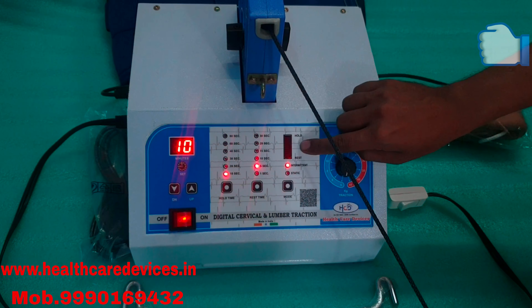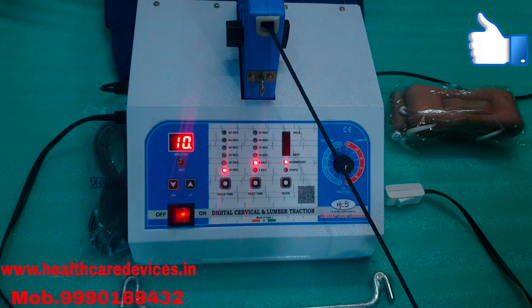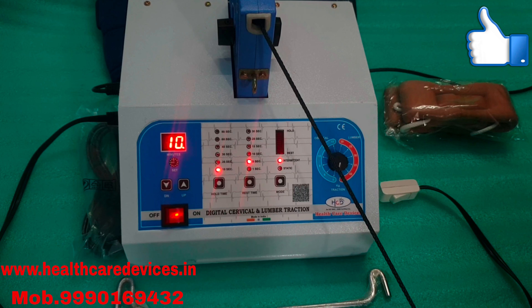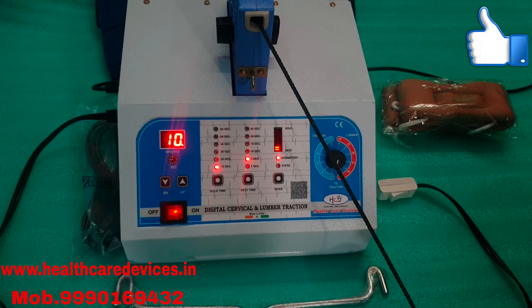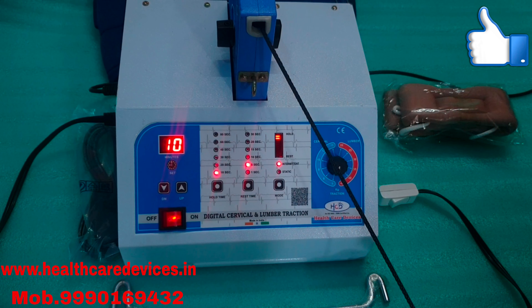Now you are looking at it — this light is down, then it will set up. You will see some effect. Now it will release, now it will hold it in 5 seconds at the second, then it will hold it.